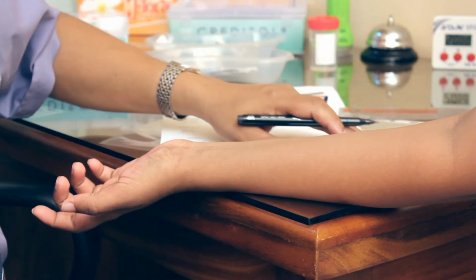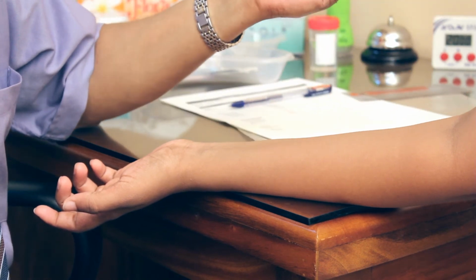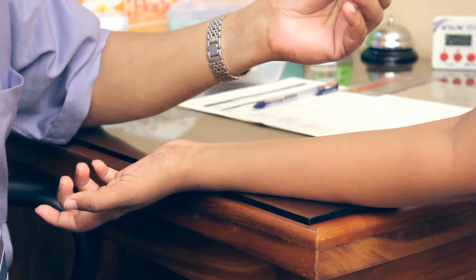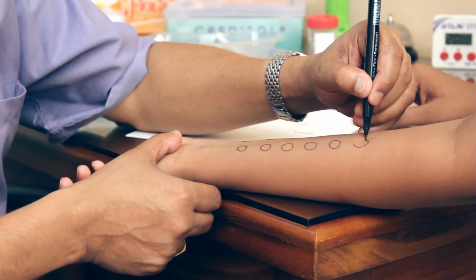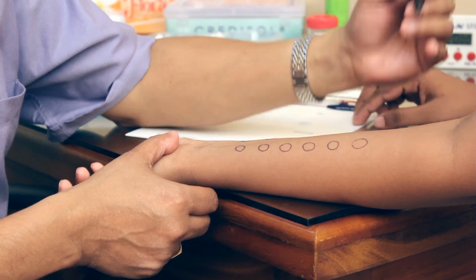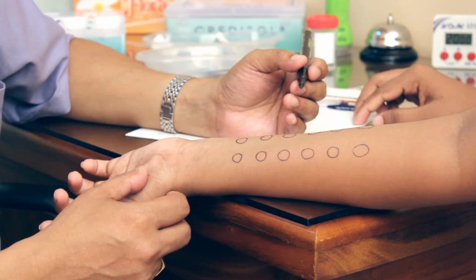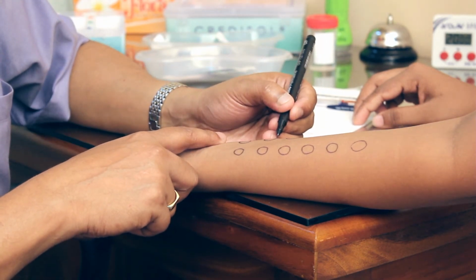Then I am proceeding with the circles which I will mark with numbers. I am marking the hand with circles. Then I am proceeding with numbers in the circles.